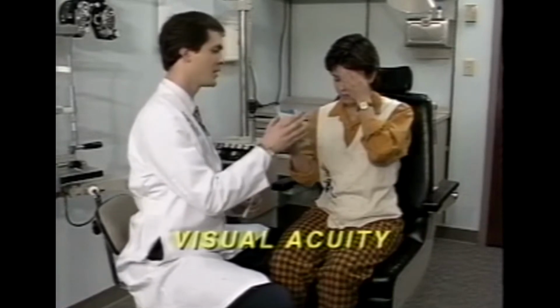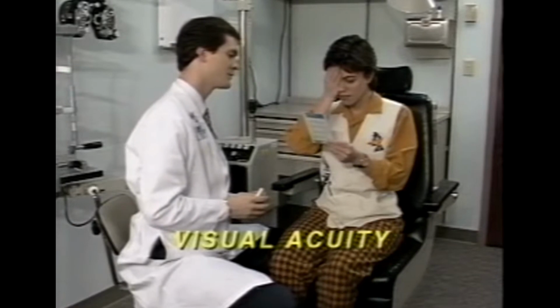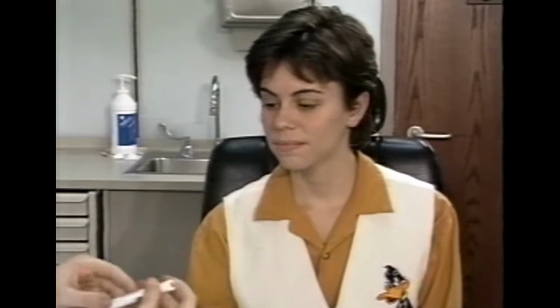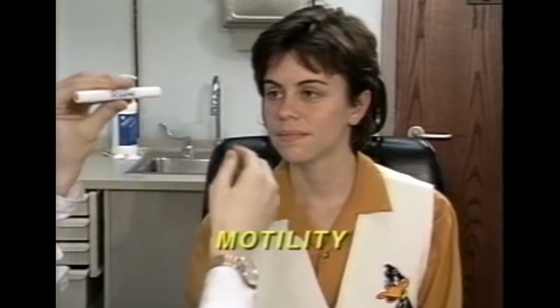428739. Cover your other eye, please. What's the smallest line of numbers that you can read there? 428739. Good. Let me have a little closer look at your eyes. Now I'd like you to look at this target and follow the target without moving your head.